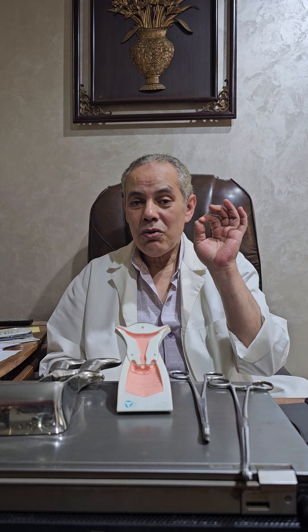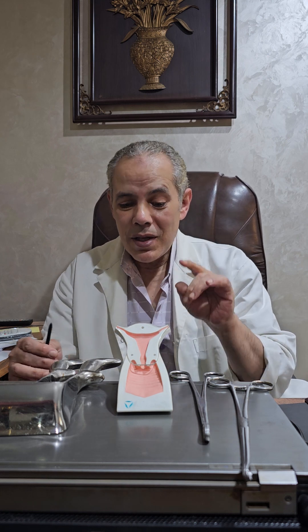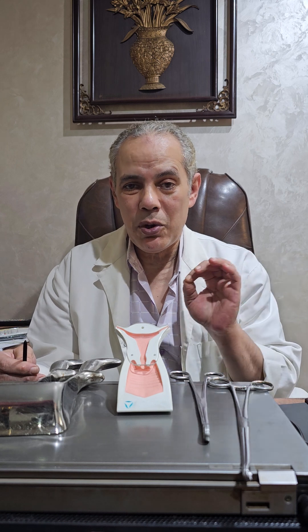Transvaginal Uterine Artery Clamping. This intervention may be needed in cases with primary postpartum hemorrhage.